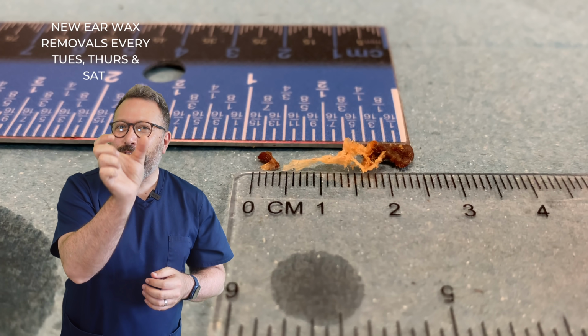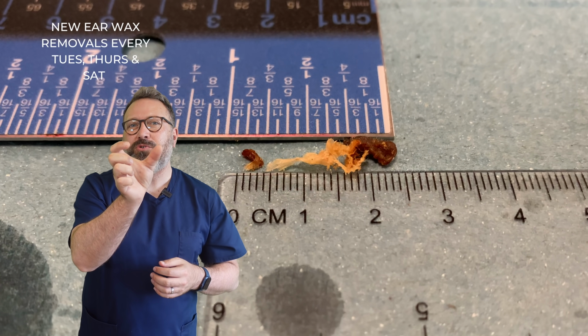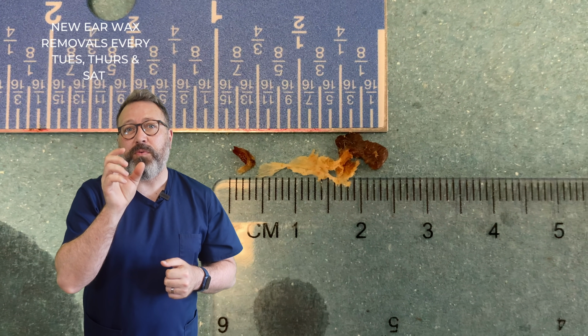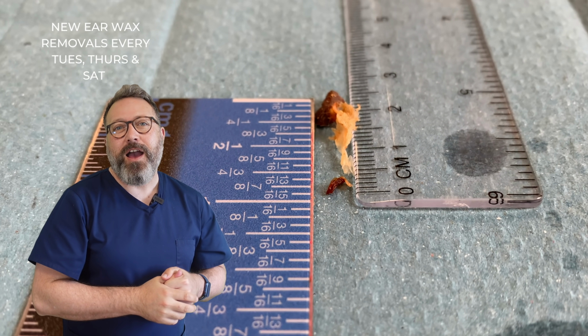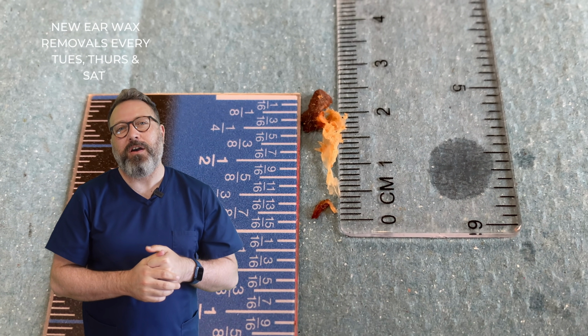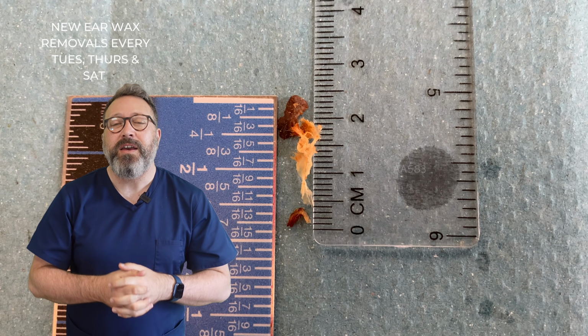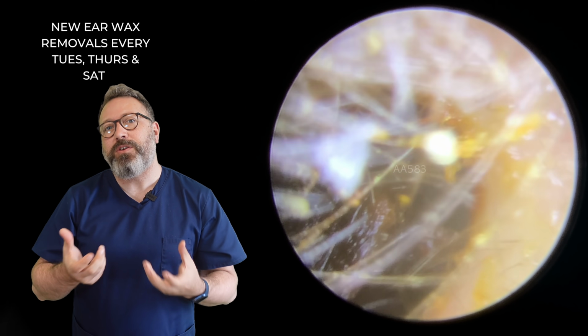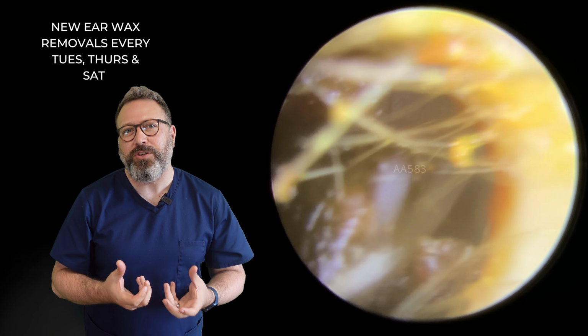So you can see that long strip of dry skin we were talking about. The piece to the left hand side, that's that tiny little bit we removed last. So what we got there, 15/16 of an inch, and we are just under 2.5 centimeters on that one when you put it all together. So not a tremendous amount of wax in itself, but enough there to be causing some real problems for this particular patient.